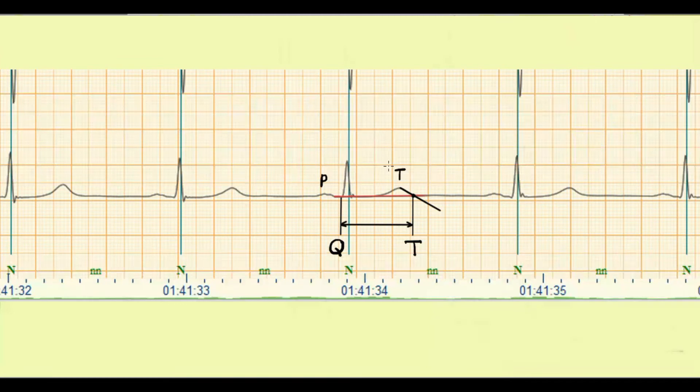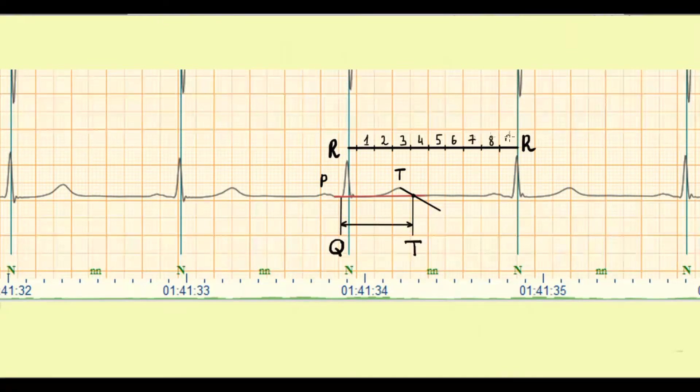Let's try. For this you need to measure RR and QT intervals and calculate the heart rate. Paper speed is 50 mm per second.